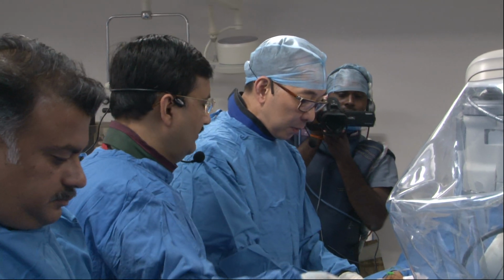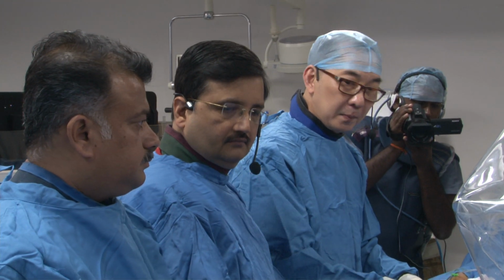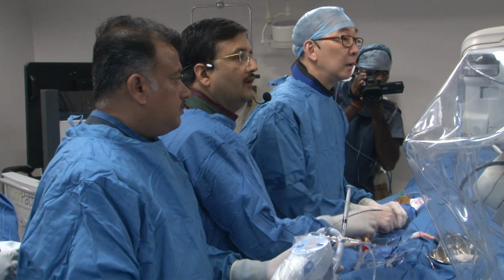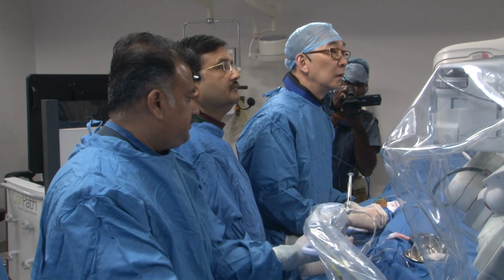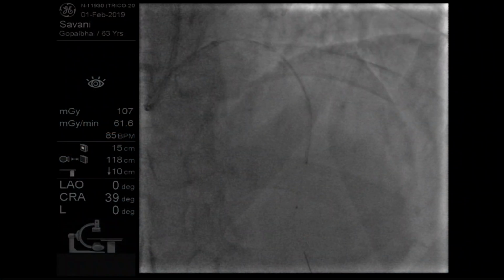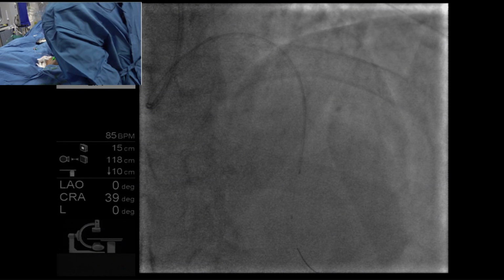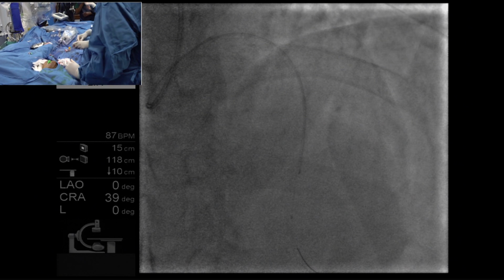In our institution, I only do IVUS guidance for the left main orifice, the RCA orifice region and CTO. In other cases, we do OCT guidance. For a long lesion, the assessment will be very fast and very understandable with OCT rather than IVUS. And of course, we have to reduce the amount of dye used.